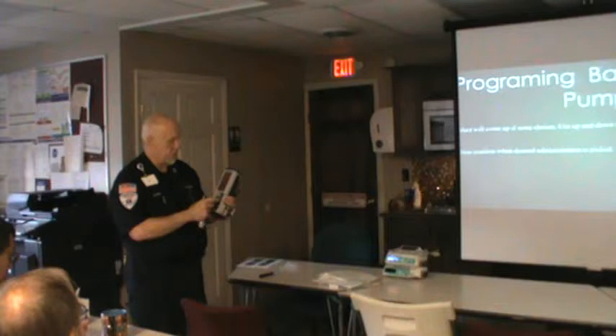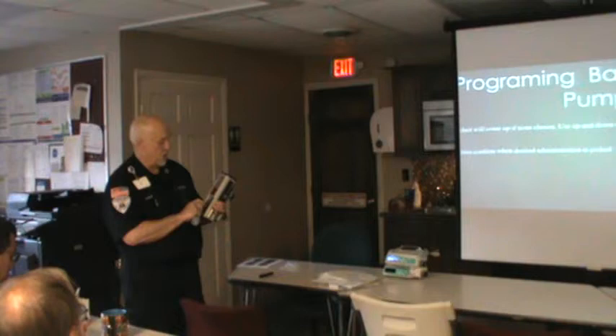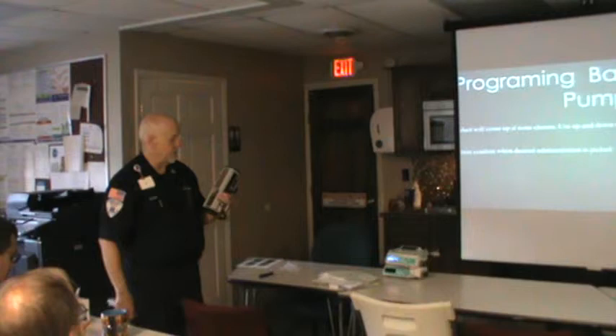Then it says 'select size' — it says 60, 30, 20, 10, 5, 3, 1. We're going to pick the 60 and press confirm. Then it says 'enter rate' — now it gets really simple.